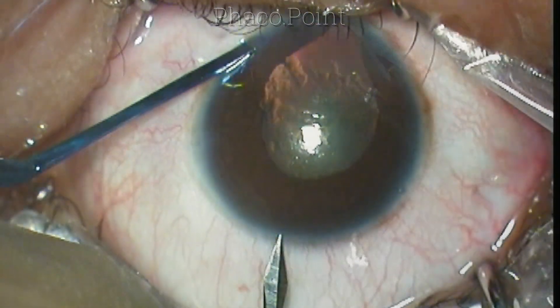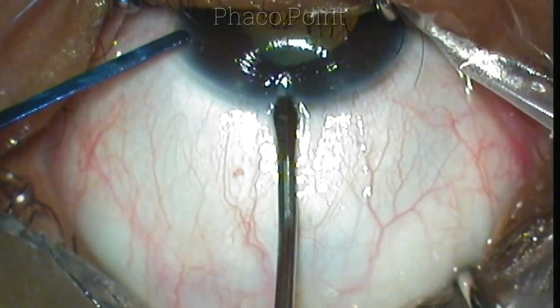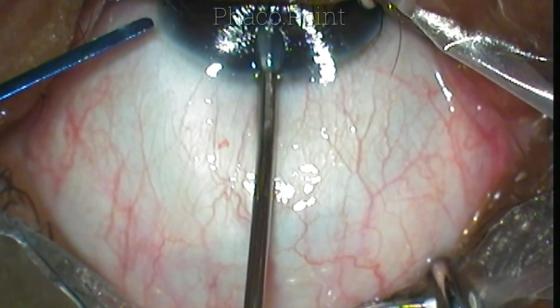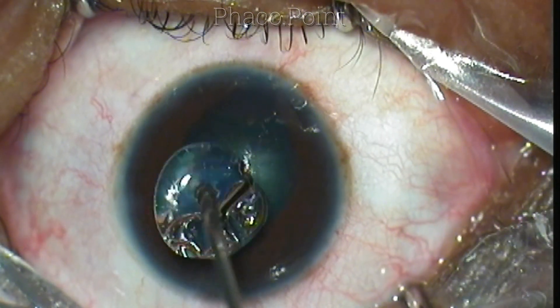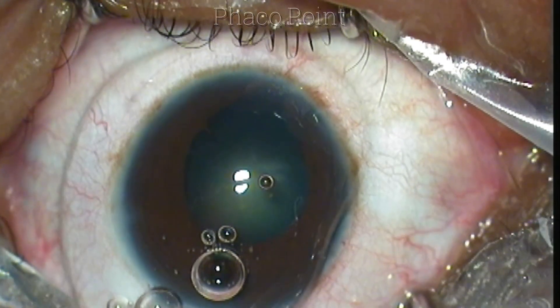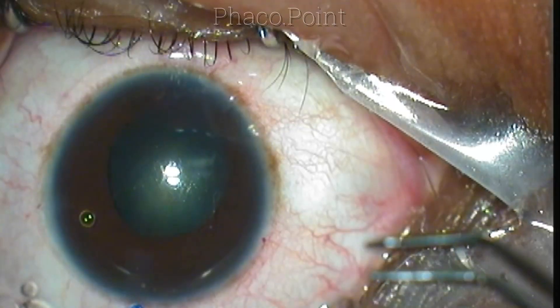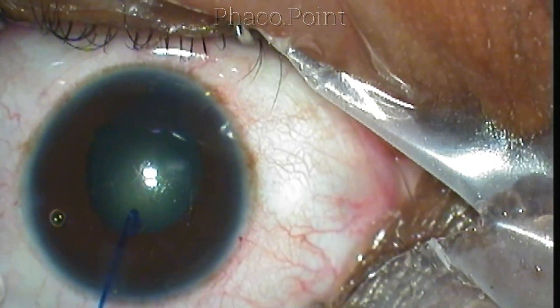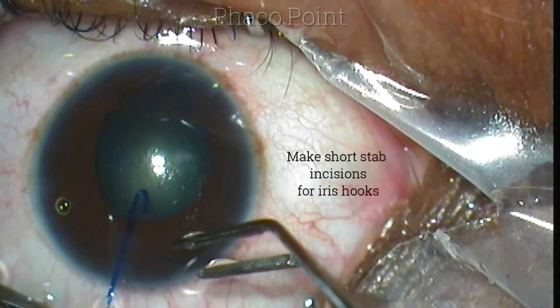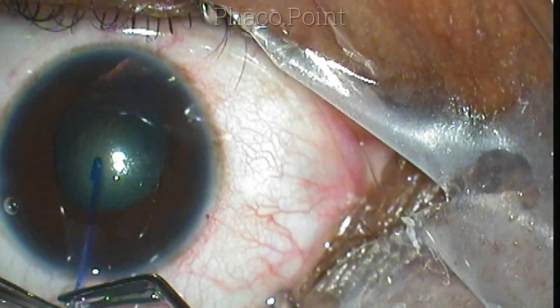The plan was to implant iris hooks first. You can see that while making the stab incision for the iris hooks, the tunnel of this incision is extremely long — more than 2.5 mm. This will come in the way of both insertion and removal of the iris hooks and has to be borne in mind. I found it very difficult to maneuver the hook across the pupillary edge, but with a little struggle I was eventually able to get it across.